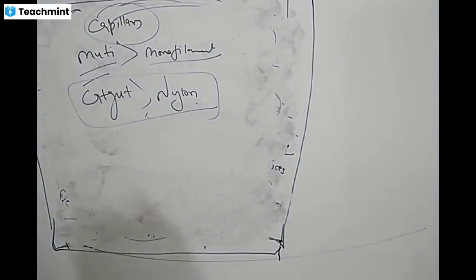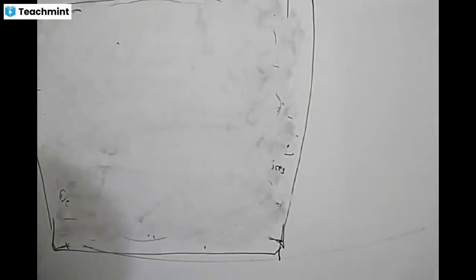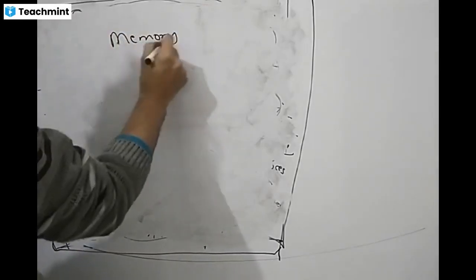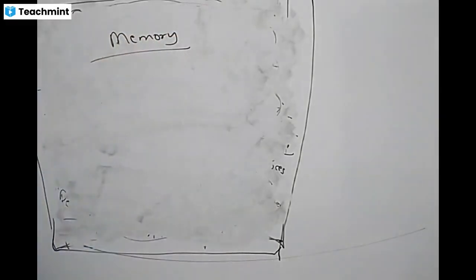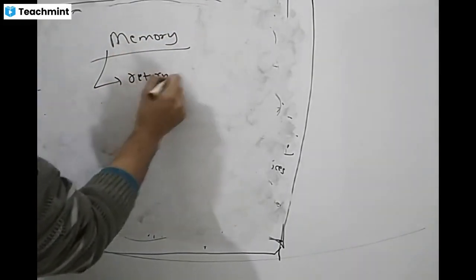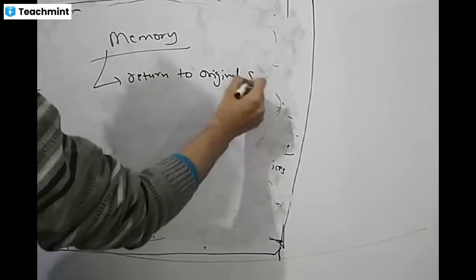The next characteristic of the suture material is memory. Memory means return to original shape.